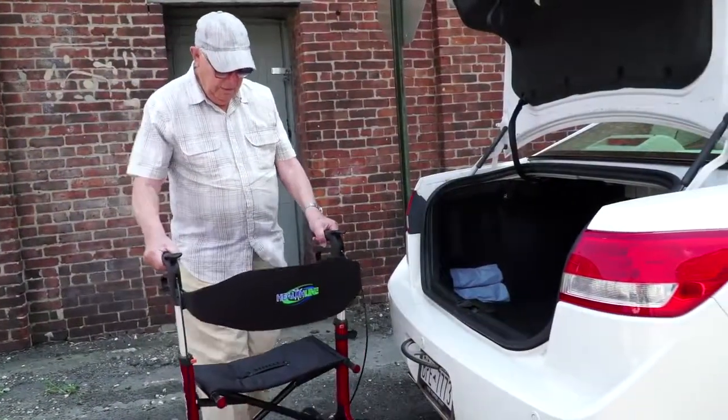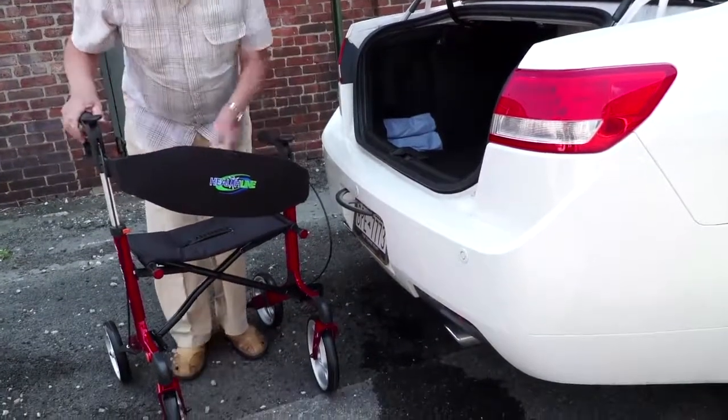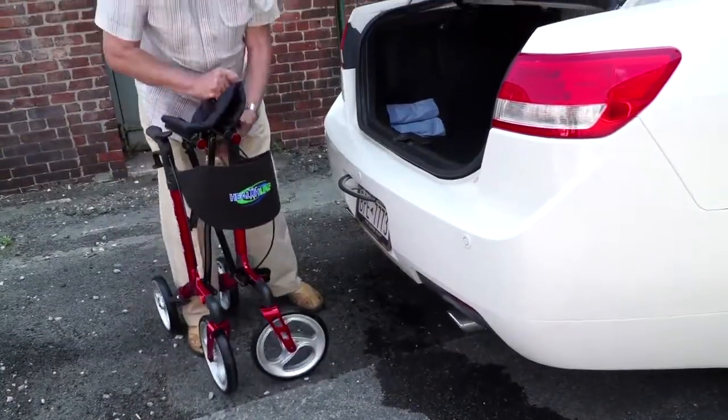You can also take your Atlantis rollator with you for a longer remote journey in the trunk of your car. To quickly fold the rollator, lower the adjustable handles all the way down and pull the soft handle on the rollator seat up.